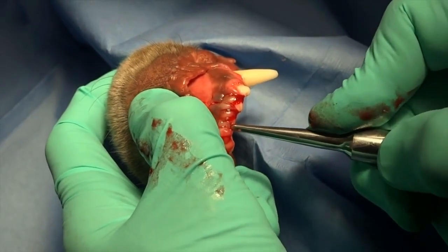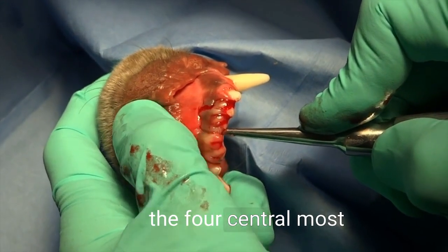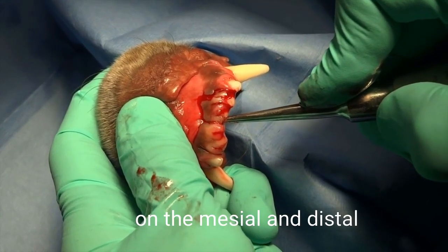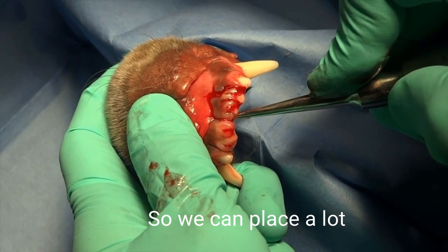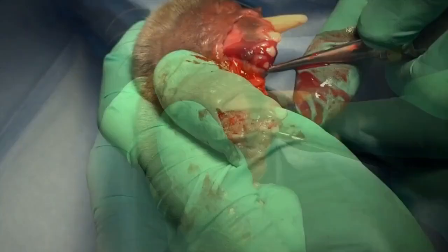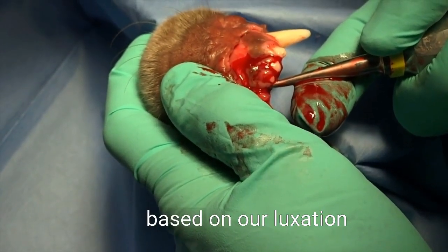Anatomically, the mandibular incisors and, to a similar extent, the four central most maxillary incisors are more or less flattened on the mesial and distal aspects of those teeth, so we can place a lot of force on those teeth without fracturing them.